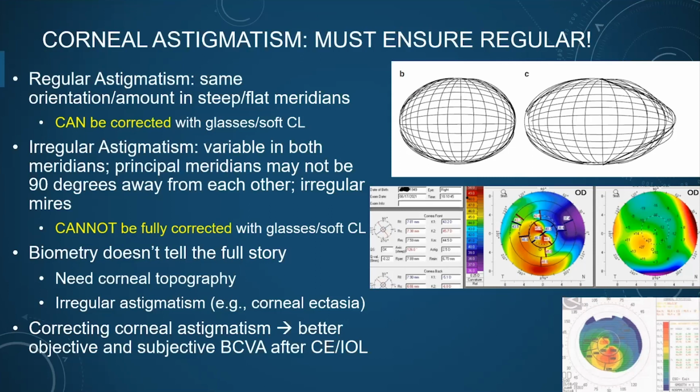So really we need corneal topography, and certainly more and more surgeons are routinely getting corneal topography, but we know that corneal topography, unless there's a medically indicated need for getting it, CMS and Medicare won't reimburse for that. So that's something you either have to eat out of pocket or find a reason to actually perform corneal topography.